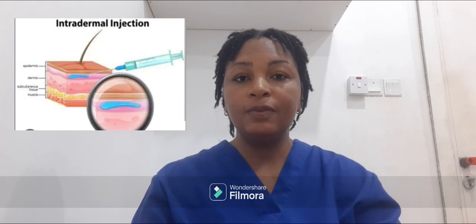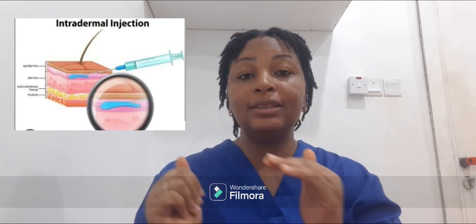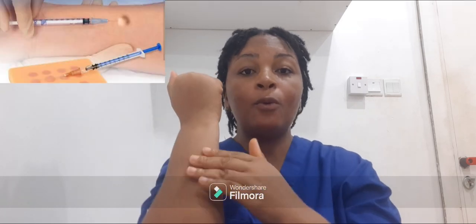So for intradermal injections, you want the injection to go right under the epidermis. So this is the epidermis, and right under the epidermis is the dermis. This is where you want to deposit your medication. So you just go right under the skin and you give it at an angle of 10 to 15 degrees. You have to be sure you are at the dermis. While injecting the medication, you will see something like this. It looks like wheals on the patient's skin while you are injecting the medication. If you don't see something like that, you may likely be injecting that medication in the subcutaneous layer of the person's skin. So these are the angles of insertion for administering injections.